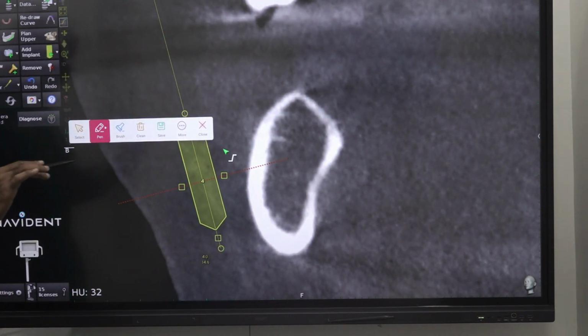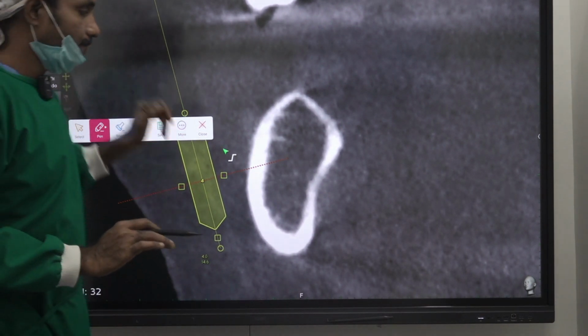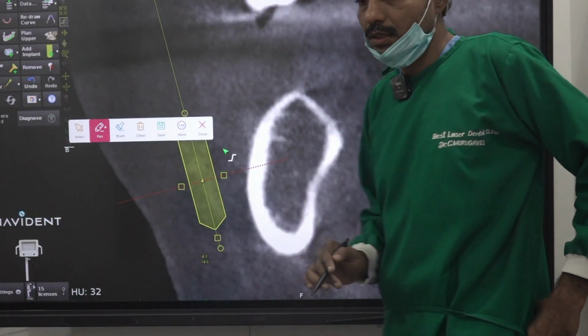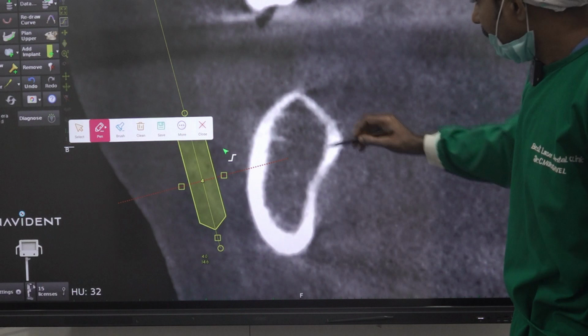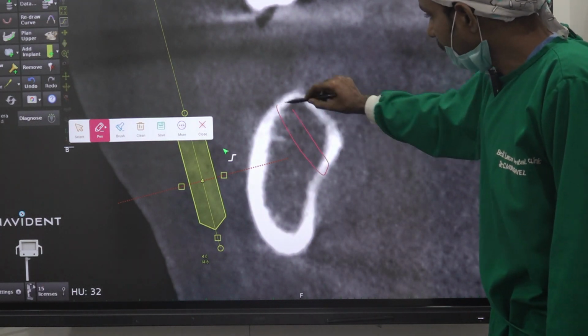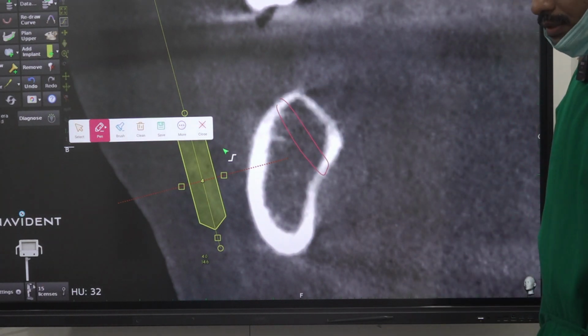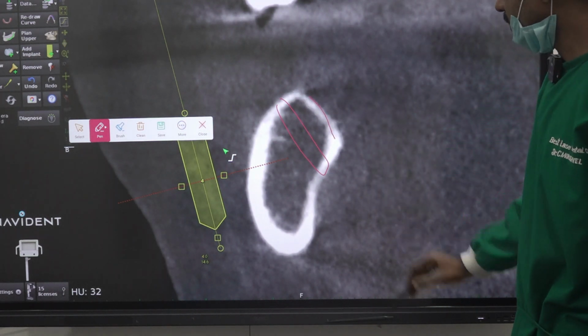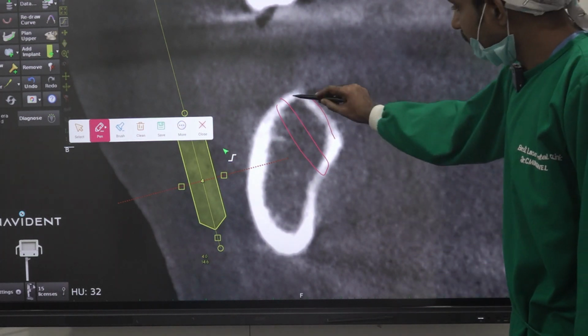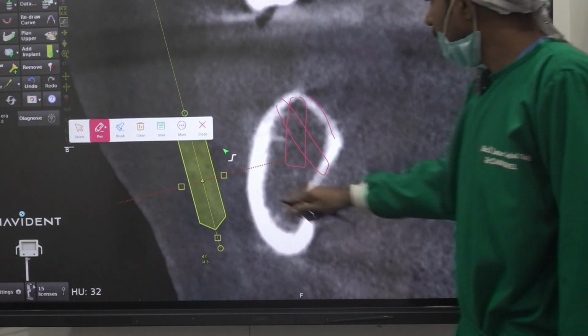So along with the implant placement or before implant placement, start vitamin D replacement weekly once. Before how many units? 60,000. Okay. Here we can try lingual cortical, but the problem is while bending, this is very weak now. This may crack. So we will place intramedullary and we will do welding.